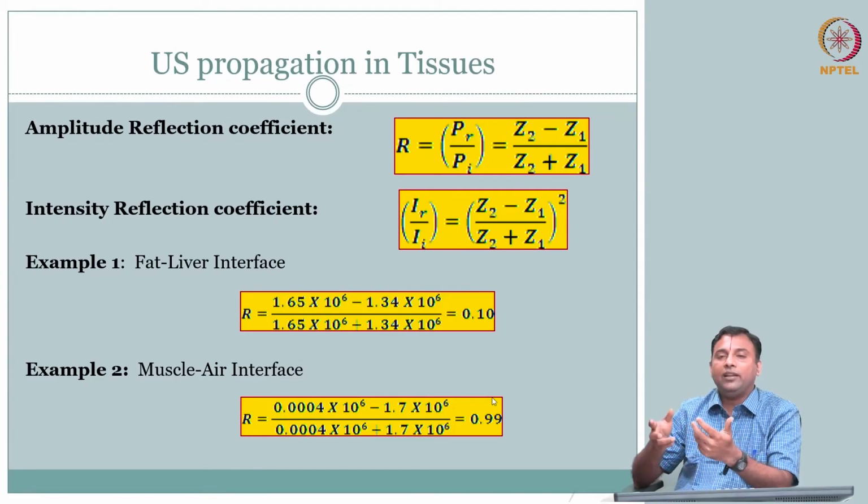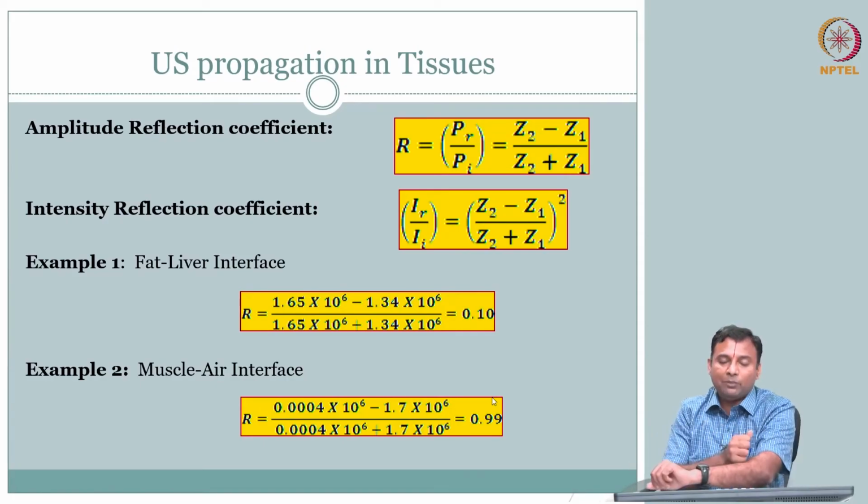So what typically they do, if you have been for an ultrasound imaging, is they put some acoustic gel, coupling gel they call it. The acoustic gel displaces the air, then we have this wave generator placed in the gel, so that the ultrasound that is generated goes through the gel and goes through the tissue. Therefore, you do not have air in between.